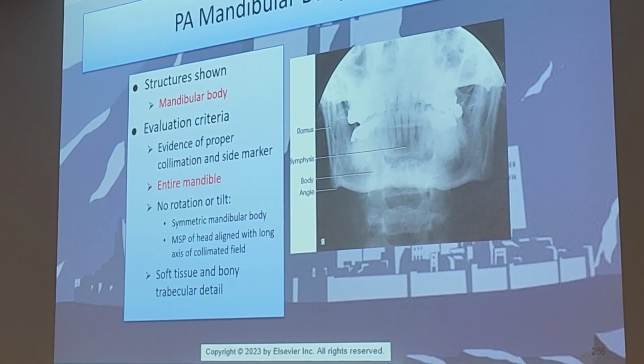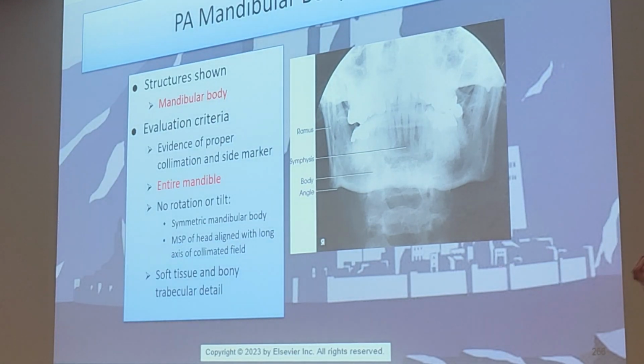All right, what are we looking at? Well, I hope we know because it says mandibular body, thus we're looking at the mandibular body. That horizontal portion, which you can see a lot clearer on this X-ray. Nice, beautiful collimation with a marker. We want the entirety of the mandible, which they do not have on this picture, by the way. Where are they cutting off? The TMJs. Come on, Merrills, you're better than that. Is that because of the centering? It's because of that circle collimation.